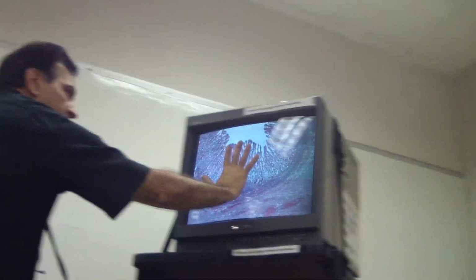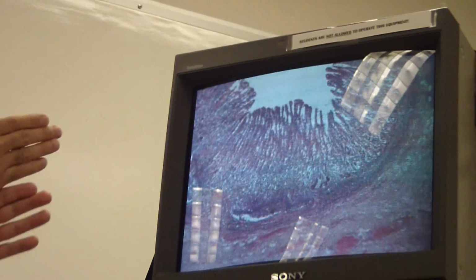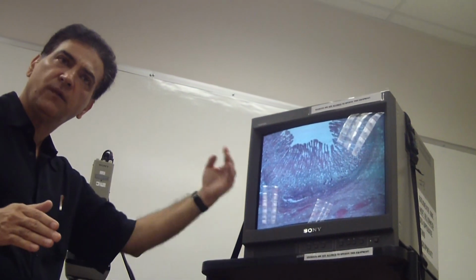Look, see how this gastric pit looks like a volcano? And take a look at those villi and microvilli. There, you can see the difference. And you can say that's the small intestine, and this will be what? And then the rest of the stuff will fall in.